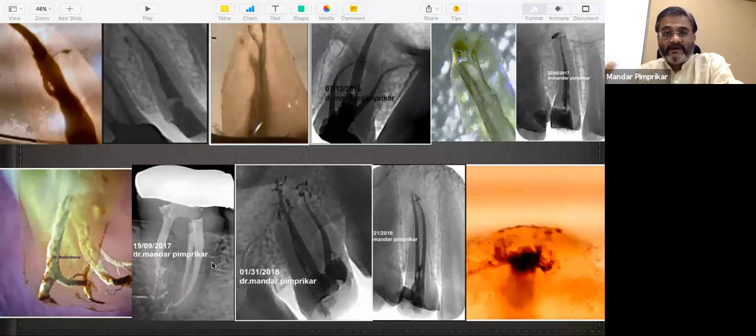But it could be a case that this apical split or a lateral canal may not be harboring an infected tissue. It could be a vital tissue there. So a clinically significant point: whenever you see a lateral lesion, apart from the periapical lesion, suspect that there is going to be a portal of exit. So if you have evidence of a lateral lesion on the root surface, that means you have to intentionally clean that lateral canal so as to make the lateral lesion heal completely.